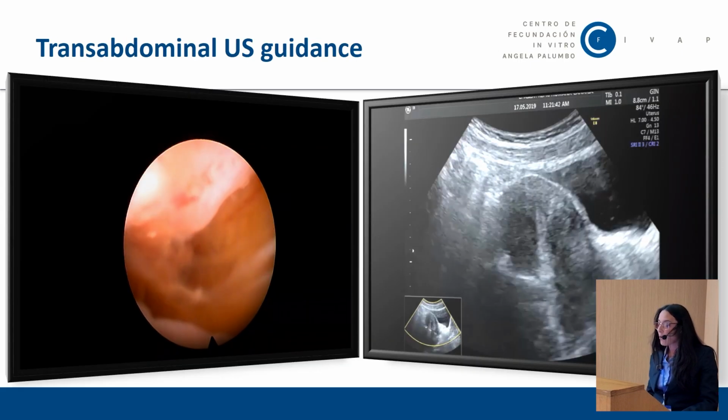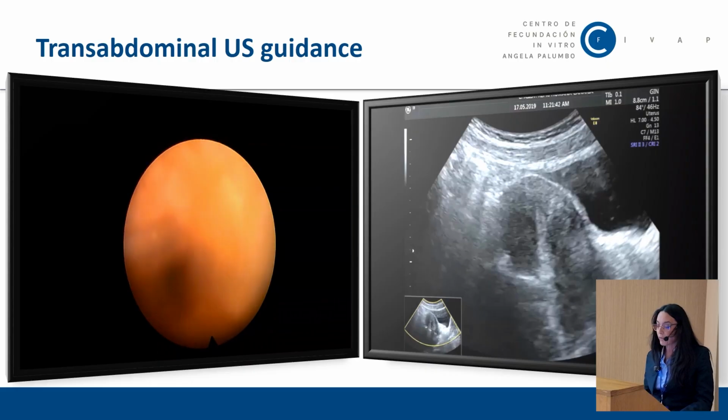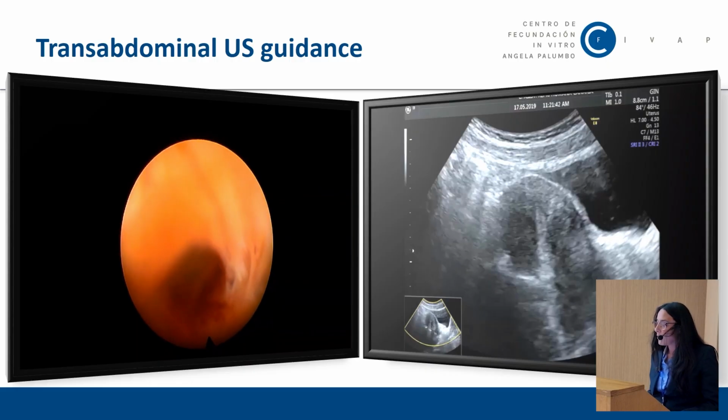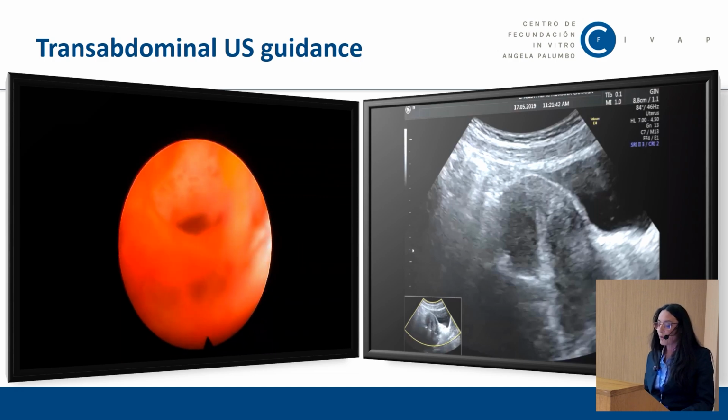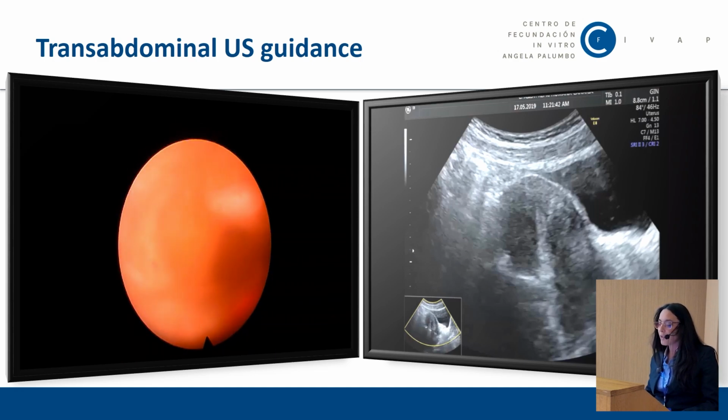Now, we can see an example of transabdominal ultrasound guidance. During the surgery, we are doing a real-time transabdominal ultrasound to guide the hysteroscopy into the cavity.